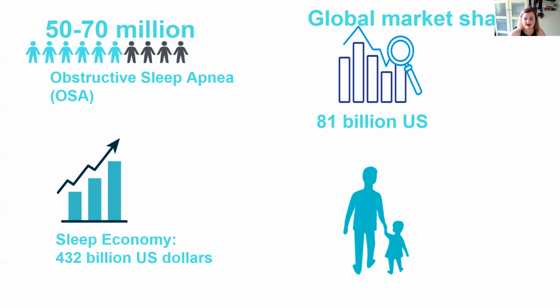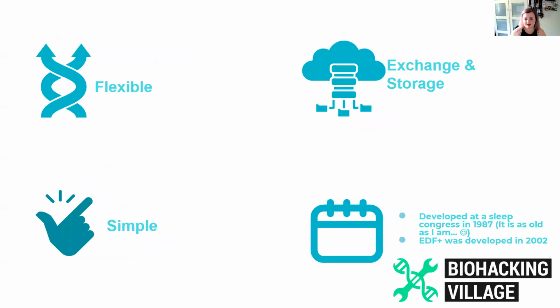Now, once you have preserved the evidence or looked at the evidence on the CPAP machine, you'll see that it makes use of a standard EDF file. Now, EDF files are generally used to record medical signals. So they are used in sleep studies largely to record brain signals and how was the patient sleeping?